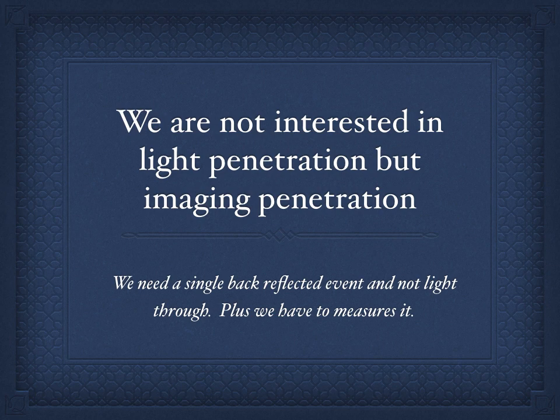But from an earlier lecture, OCT is a ranging-based technique. This means that a photon is sent at the sample and back reflected just once toward the detector. It can't bounce around or the time of flight will be inaccurate. I'm going to give you a classical description of that. Imagine you have 1 millimeter of tissue on a reflector like a mirror. If light goes in and comes back, that time of flight is calculated by the system, and then plotted as 1 millimeter.